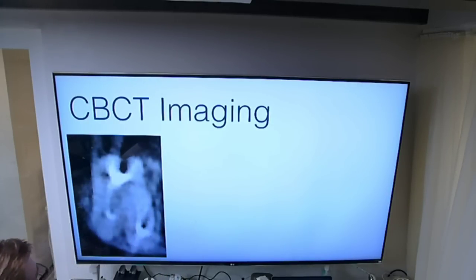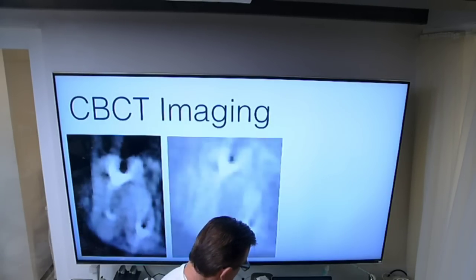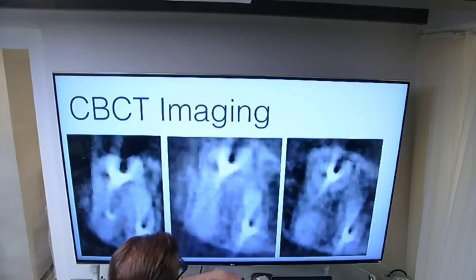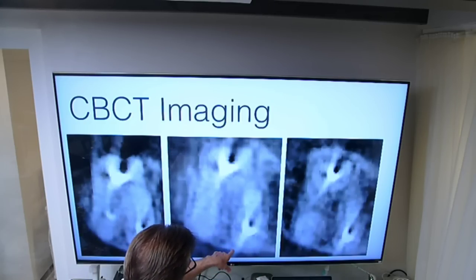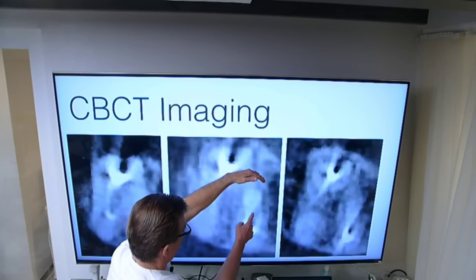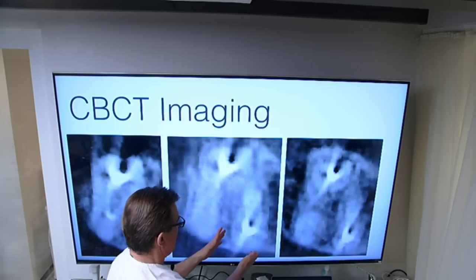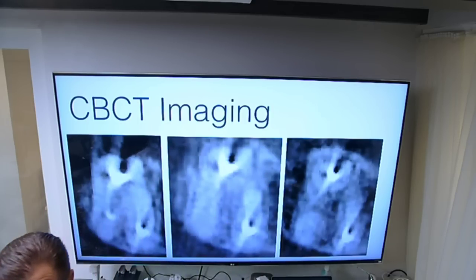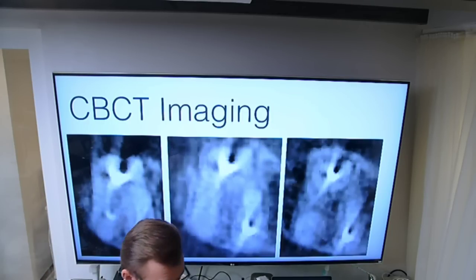Here are the cross-sectional views. CT imaging is a little bit, well, it's really pixelated. What we see here is, I'm looking primarily for the MB root. Unfortunately, this doesn't show enough resolution, but here's the MB root from here to here. We see the MB1 canal. There's a little space here. It's kidney bean shaped. If it's less than round, if it's more oblong, you're going to find at least a fin. Okay, so we don't necessarily have to look for that, but we're going to maybe expect to see that in the post-op.